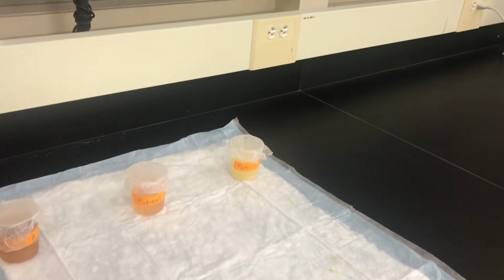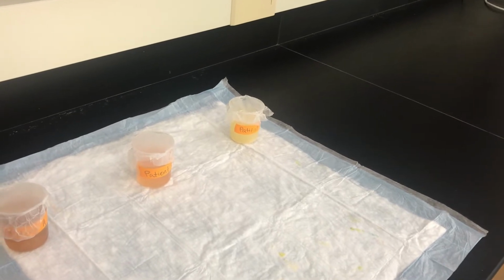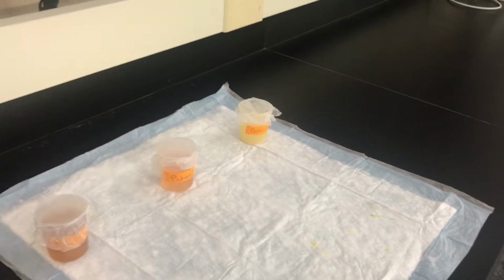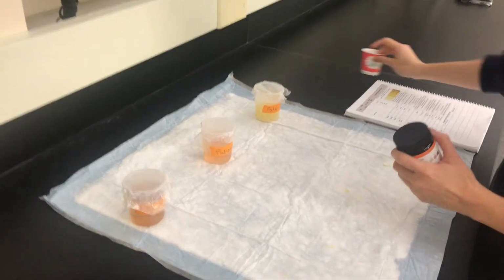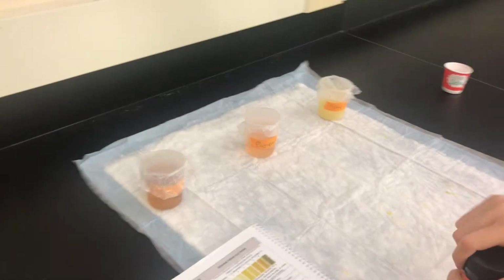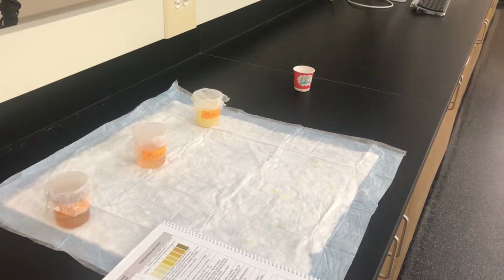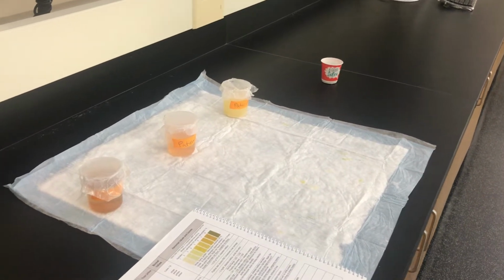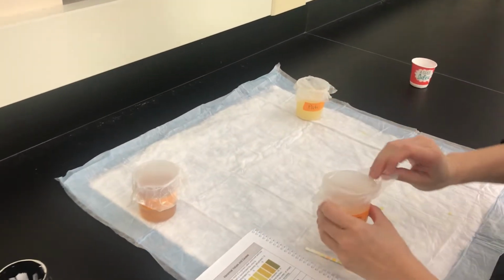All right, so what we're going to do here is test a particular patient. So I'm going to see if I can grab a little patient stick. All right, so which patient are we going to try? The middle one. All right, patient B. Thank you, Anita. Your peer facilitators are giving you a dipstick, and what you want to do for patient B is we're going to open up patient B, okay?